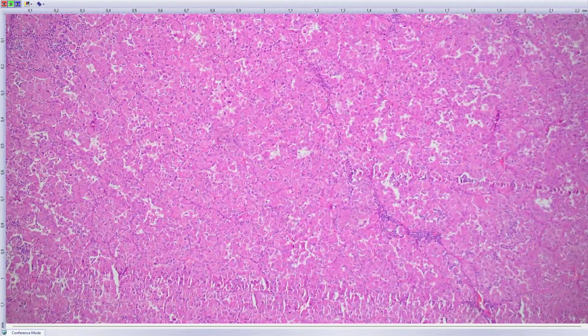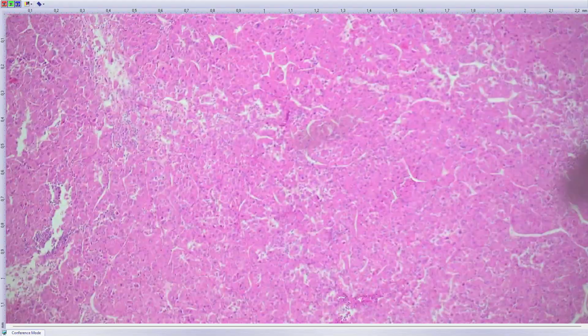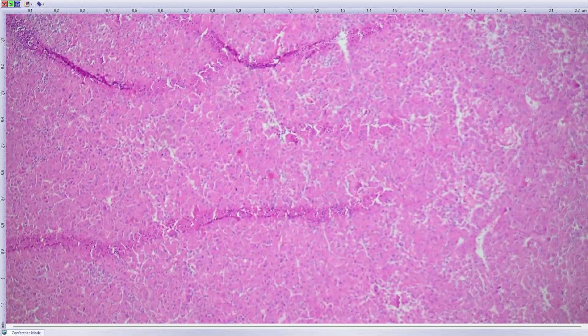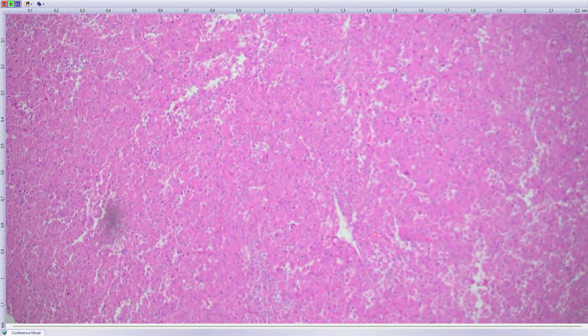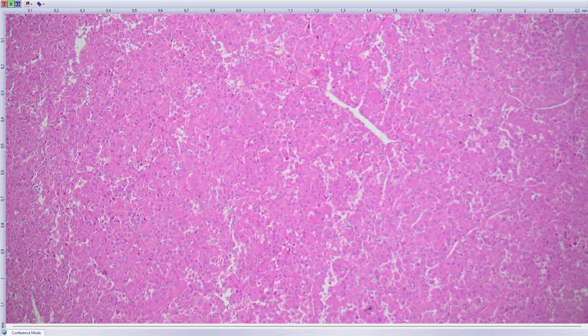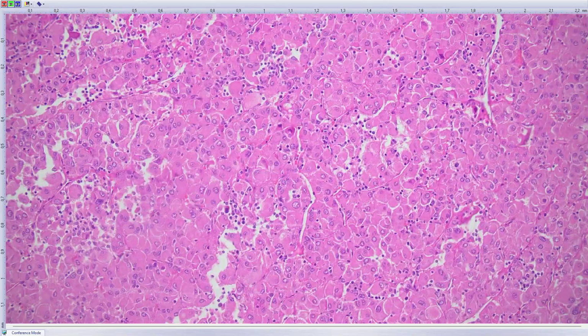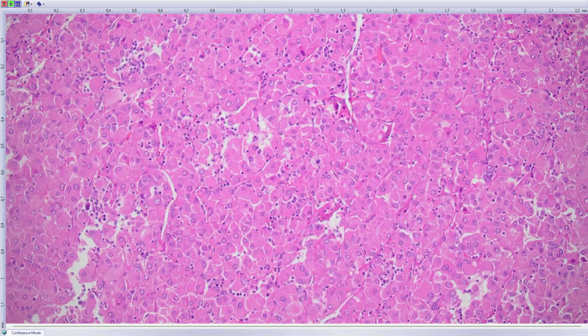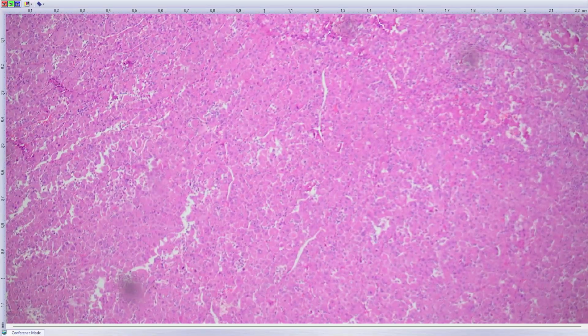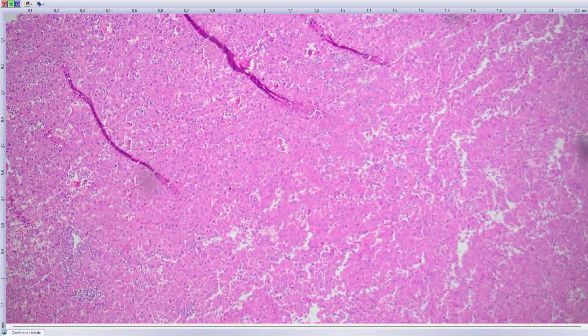There's the liver, and look at the tumor. It looks very different from what we saw. The pathologist who was doing this diagnosis mentioned that the morphology is different. He can't exclude that this is some GIST going wild, but it looks like basically a PEComa or even alveolar soft part sarcoma, and ordered molecular testing, which wasn't done in the first tumor in the stomach.